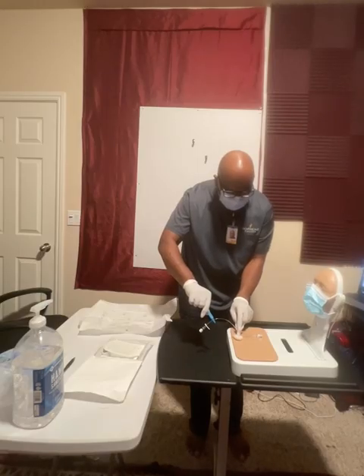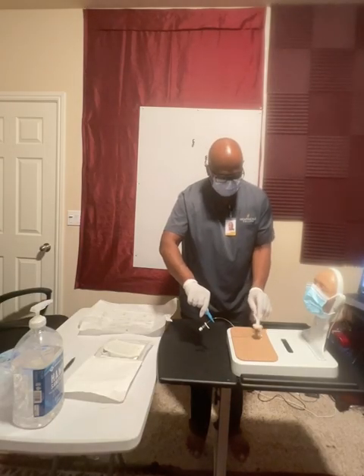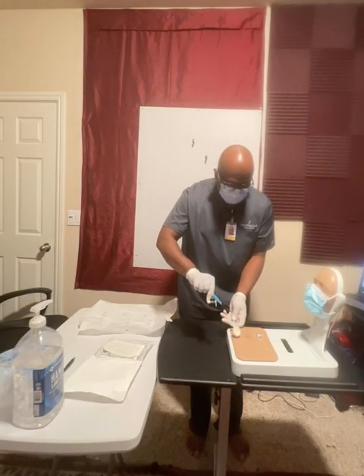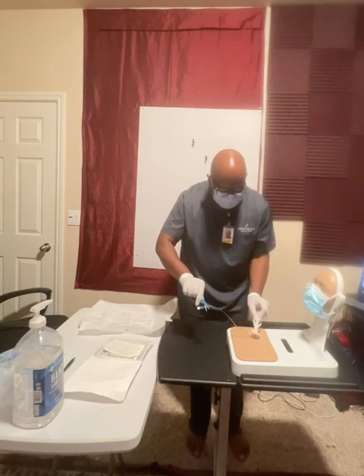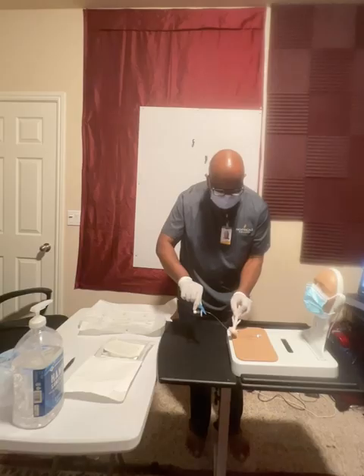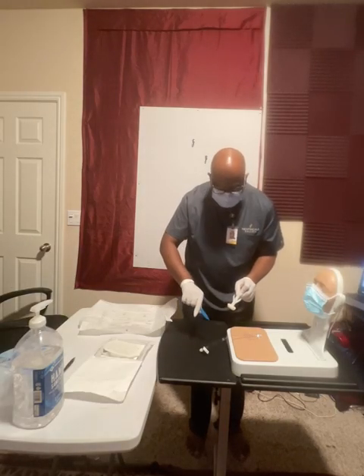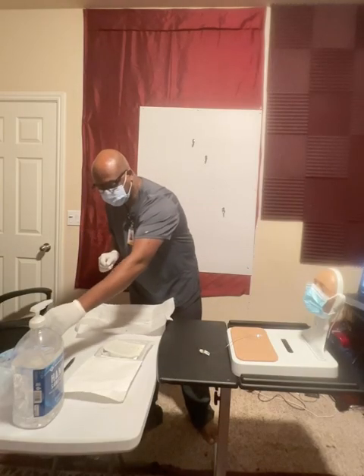Now it's important that we're cleaning the size of what the new dressing is going to cover up. Those are the areas that we're cleaning. So we're cleaning back and forth. Now, we want to clean underneath the tubing, and we're going to clean the top of the tubing. And we're going to gently put this down. Good. We're going to dispose of this one.